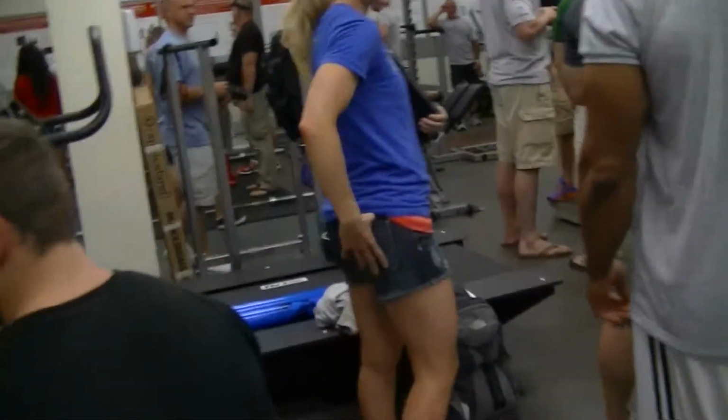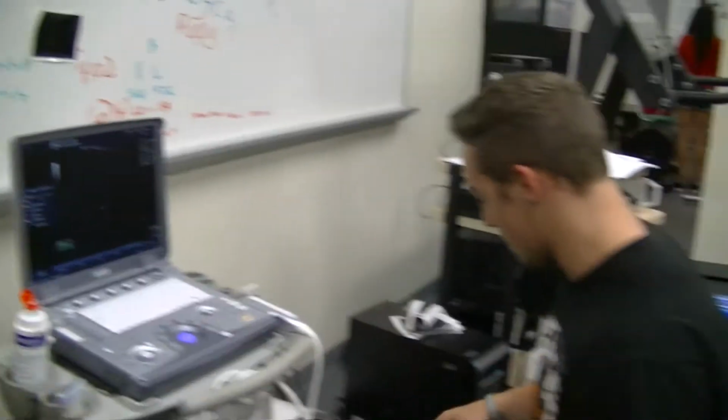Okay, can you explain it one more time now that I'm recording it? So we're just measuring muscle thickness with the ultrasound. We take a picture cross-sectionally, and then we measure from the bone to the bottom of the skin. Just the distance in between is your muscular thickness of your quad. Okay, awesome. Thank you.